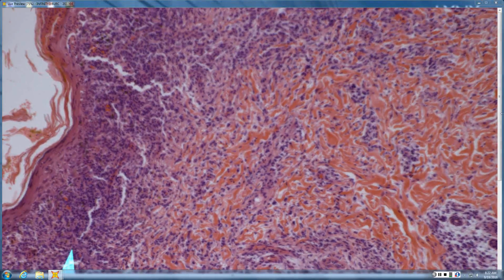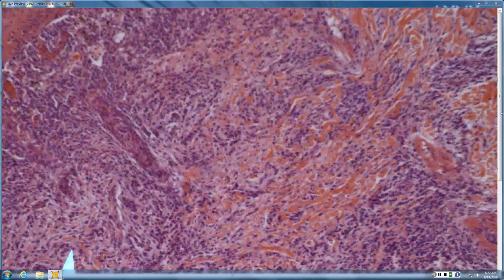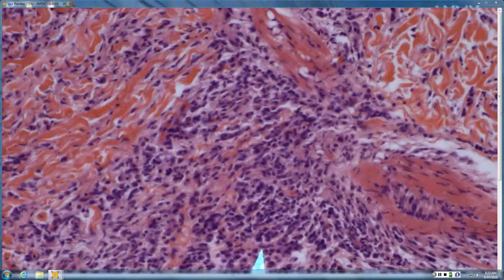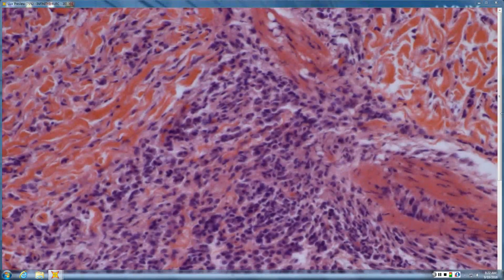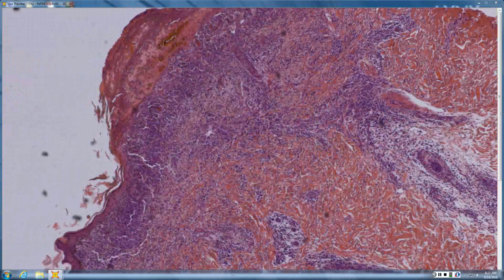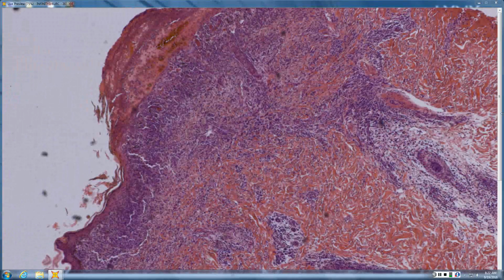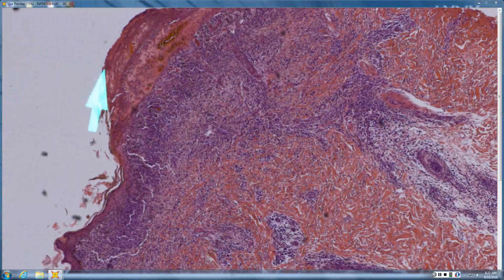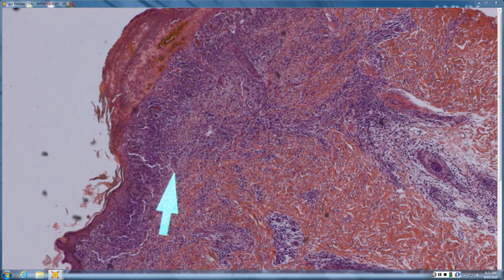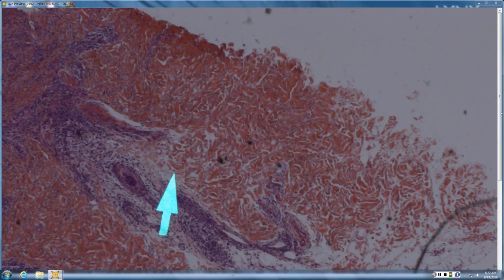Well, we're thinking syphilis. This is raging syphilis. And if you look higher, you have plasma cells in this one, but a third of cases of syphilis don't have plasma cells. Unless you think it's acceptable to let a third of your patients get tabes, then you've got to look beyond plasma cells. But scale crust, interface process, busy dermis, endothelial swelling, syphilis. Is that mucin or is that just edema around that vessel? Edema in this case. You could always stain it if there's a question.